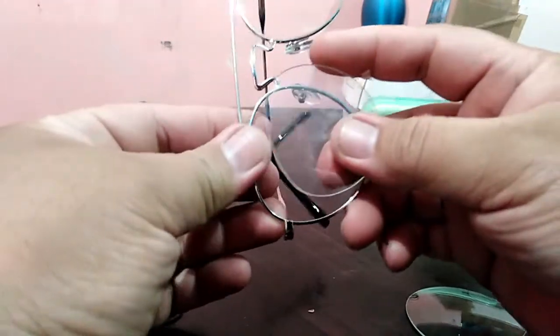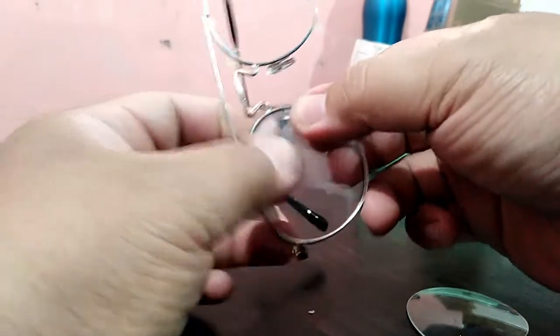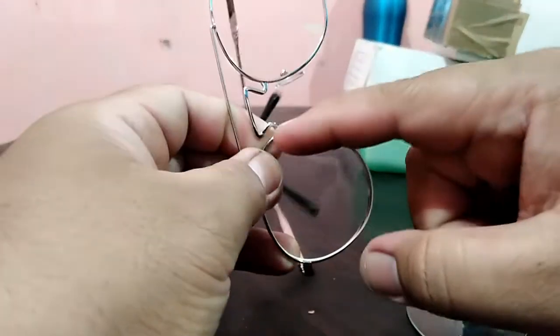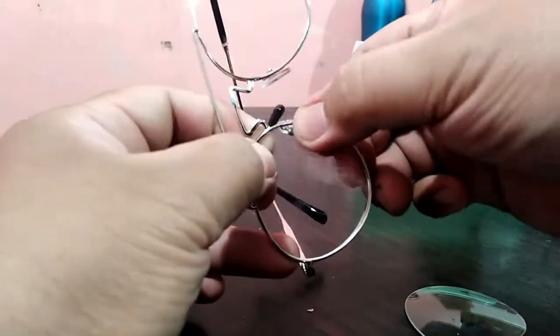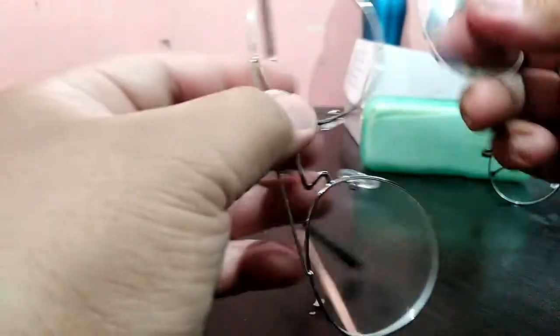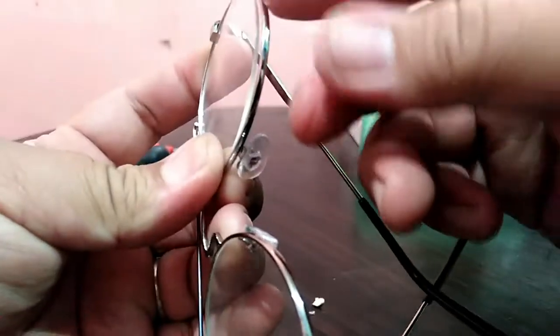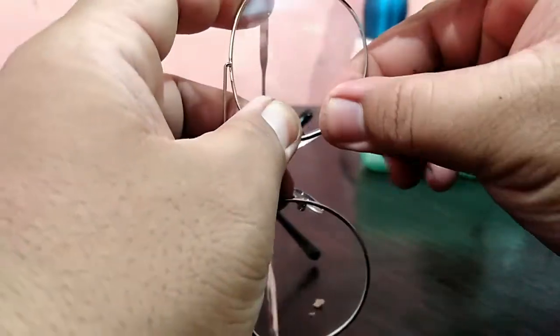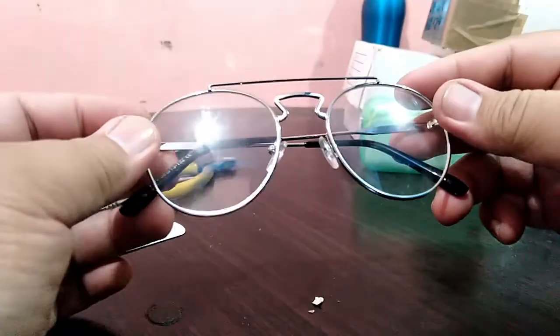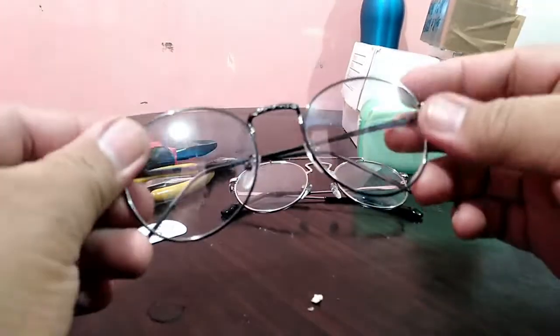Once you put the lens back on the new frame, first insert on the temple side, then make sure to insert and you can hear the snap. It's inserted. Same way — nasal and temple side first, and the lower part is the last part. Push and snap, and you've successfully inserted the lens.